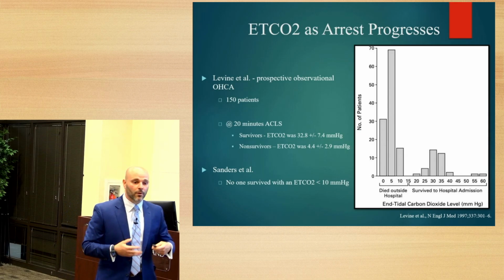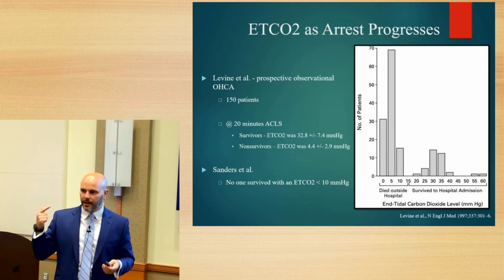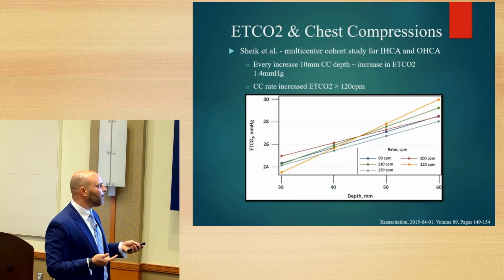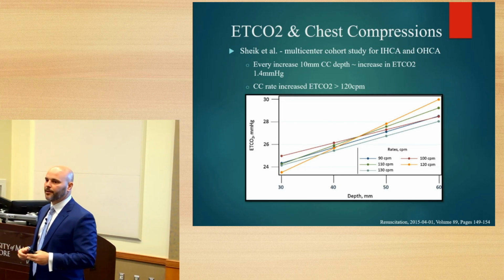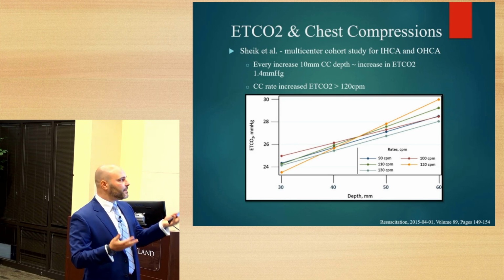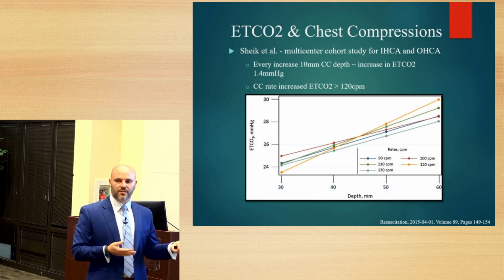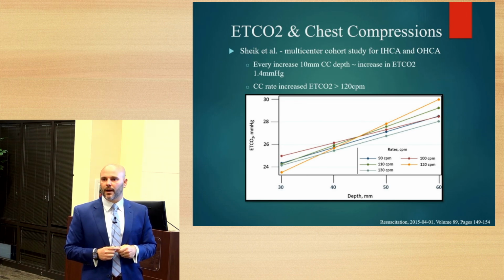Now, how do we do that? What are the pillars of cardiac arrest? It's early defibrillation and it's good quality CPR. So as you can imagine, good quality CPR will help raise your end-tidal CO2. You're trying to mimic that perfusing rhythm. And this study actually shows that the depth of the chest compressions made your end-tidal CO2 rise.